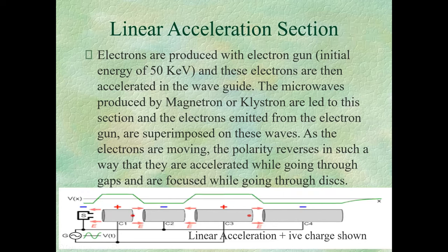Then we have enhanced dynamic wedges. Those are called EDWs. Last few minutes, you have seven more minutes, please. So I think I'm done. These were the last slides, and MLCs. These can be tertiary collimators or some accelerators have them instead of one of the fixed jaws. So those were the details.